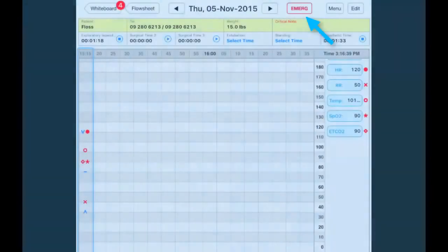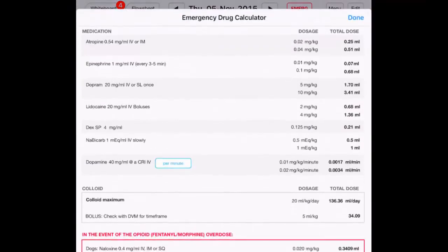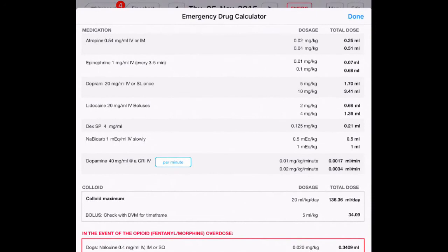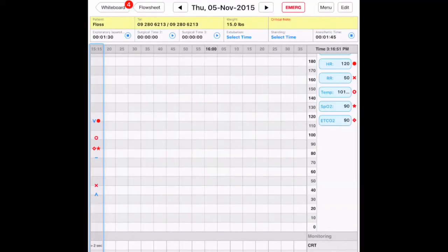At the top of the page is the emergency drug calculator. Based on the weight of the patient you entered, the emergency drugs are automatically calculated for you here.